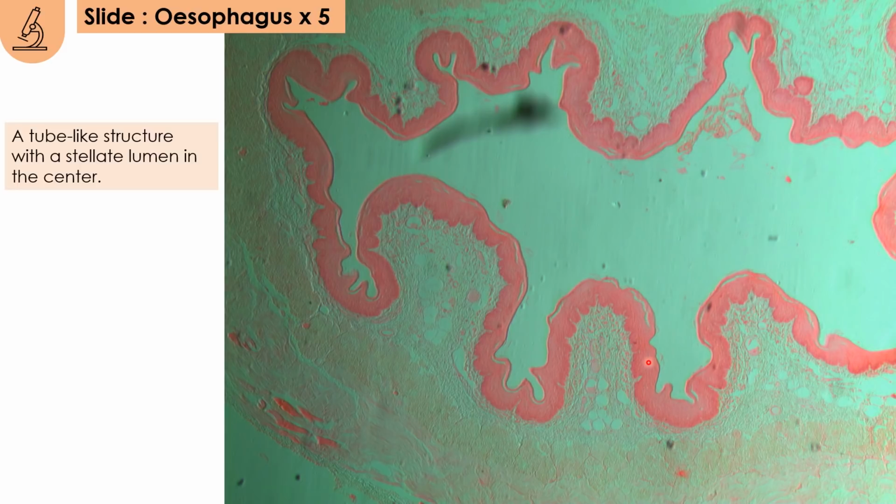Remember the gastrointestinal tract, when I talked about the duodenum, they have a similar arrangement, composed of 4 layers: mucosa, submucosa, the muscularis propria layer, the third layer, and then the adventitia. You can appreciate them here. But in this practical, we are going to focus only on the mucosa.